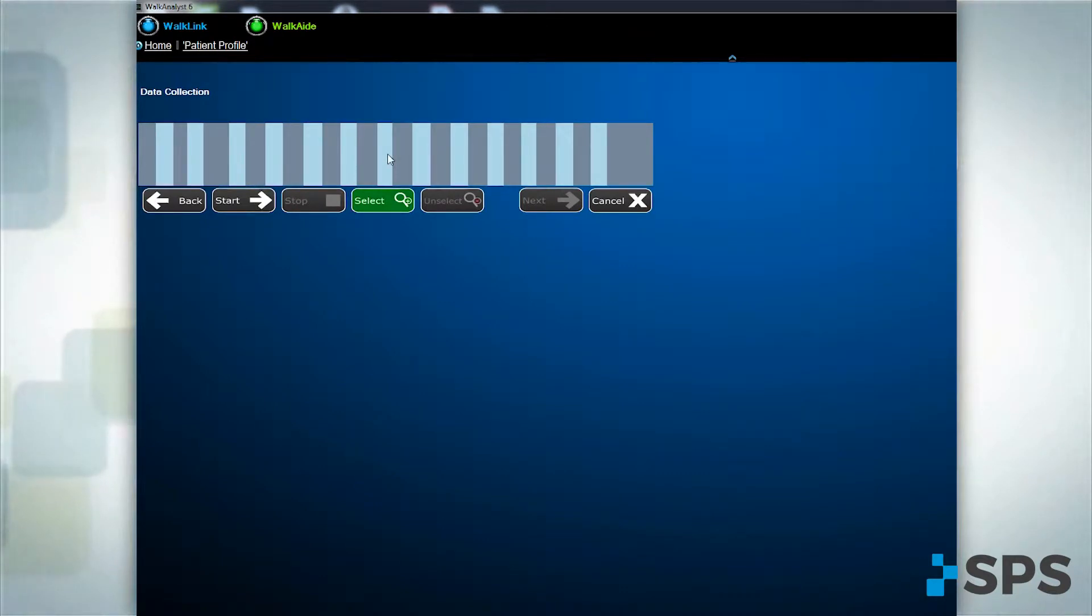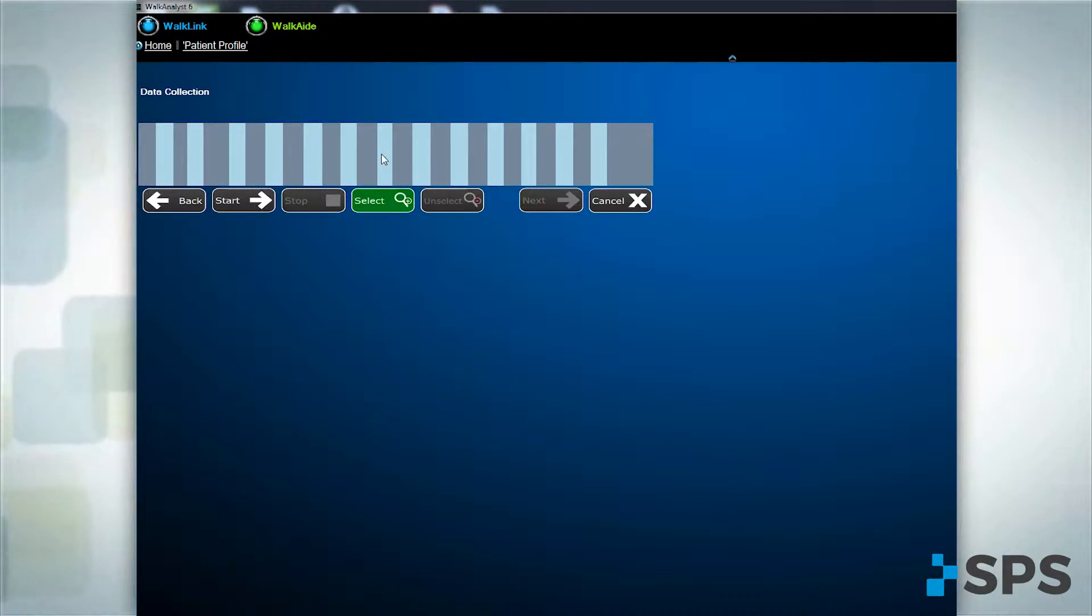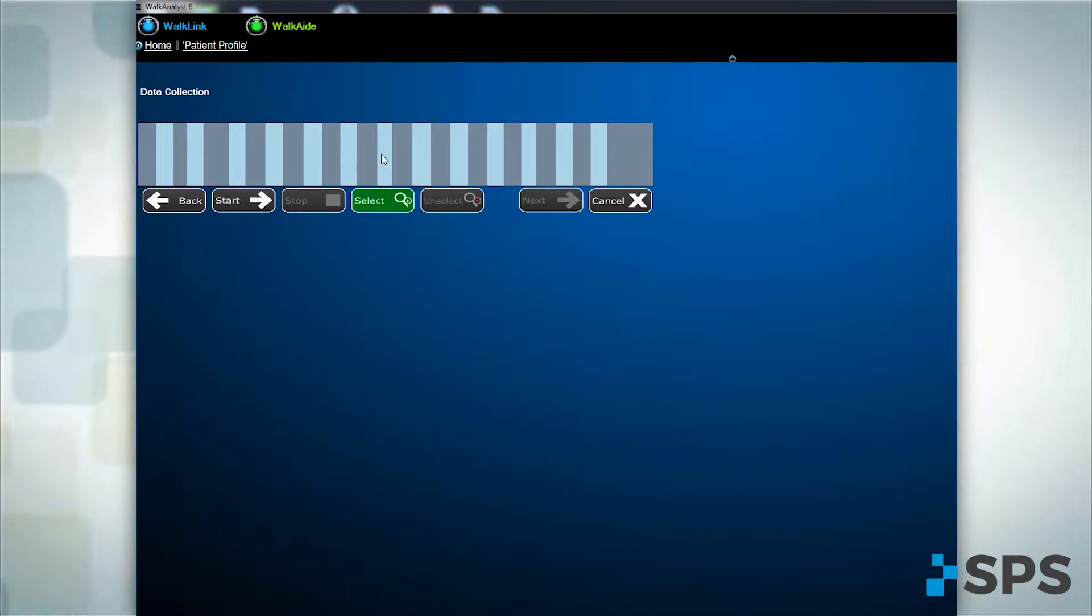You will see a series of bars representing the stimulation you provided with each step. Light color bars represent the swing phase of each step, with their thickness equal to the stimulation duration.